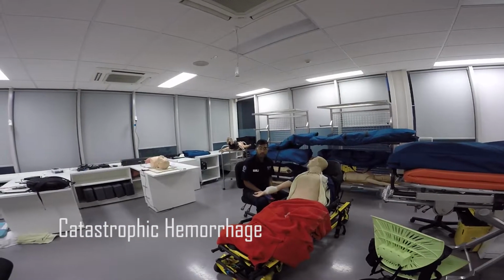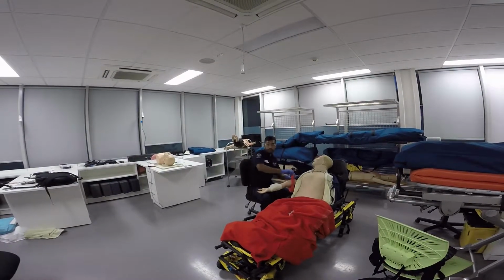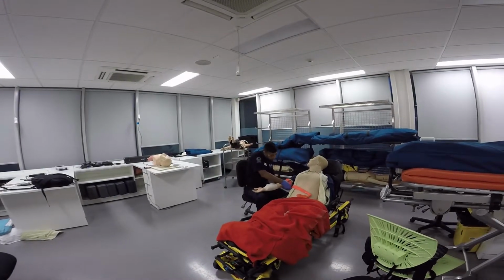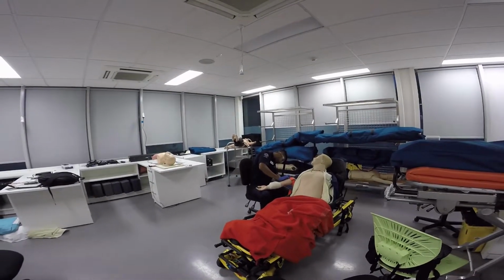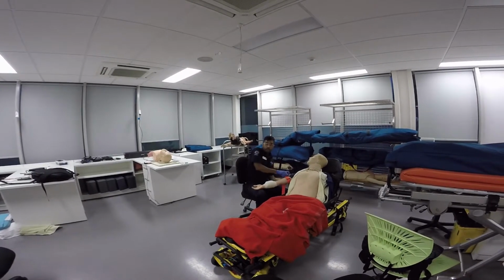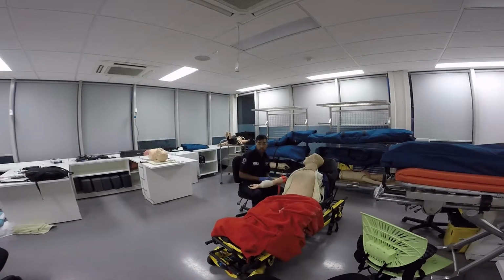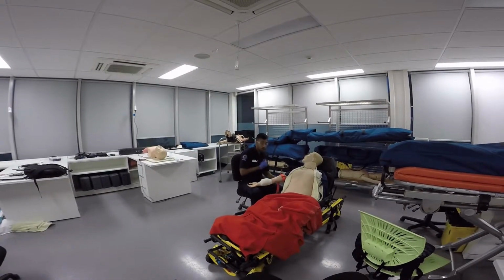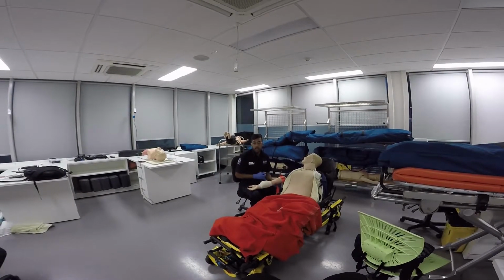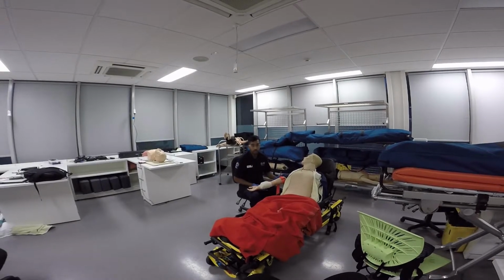If bleeding is not controlled, you can apply a tourniquet 10 centimeters proximal to the wound, like so, and tightening it on a single bone limb. Tighten the windlass until the patient stops bleeding or a distal pulse disappears, and you can document the time as required when you place the tourniquet, and ensure that the tourniquet is visible, and you can also apply a second tourniquet on the patient if needed.